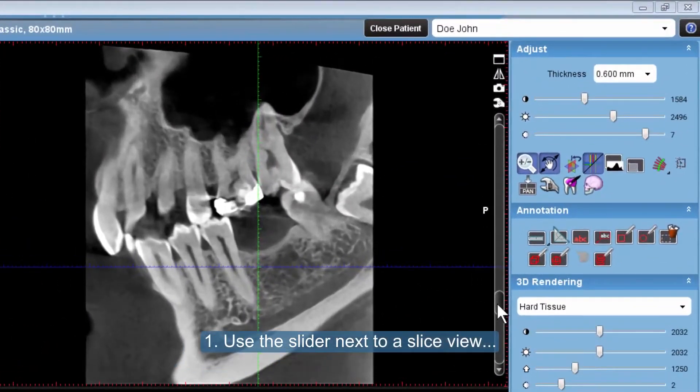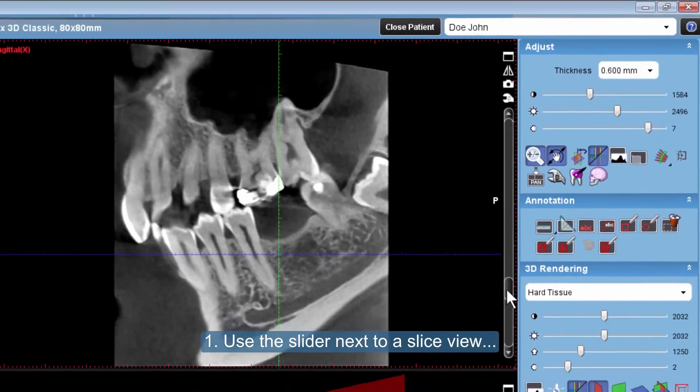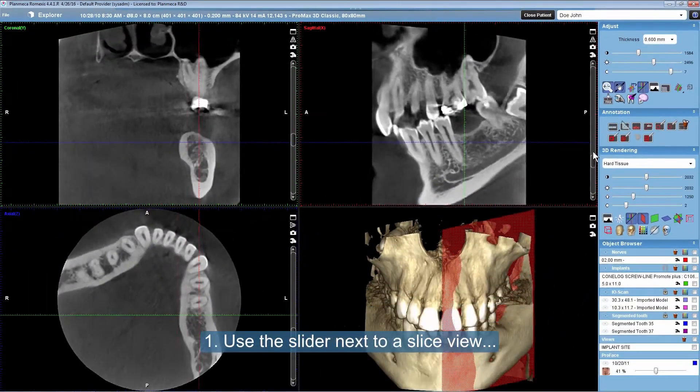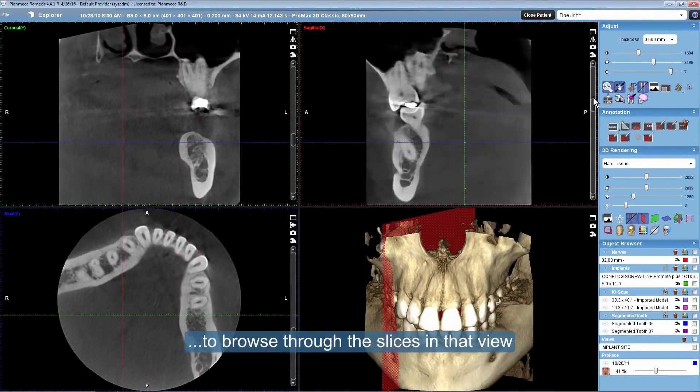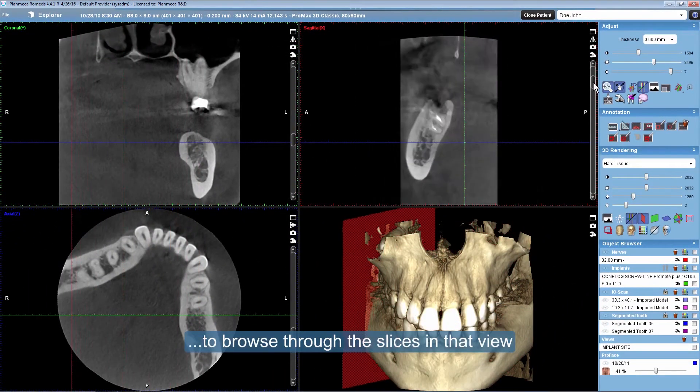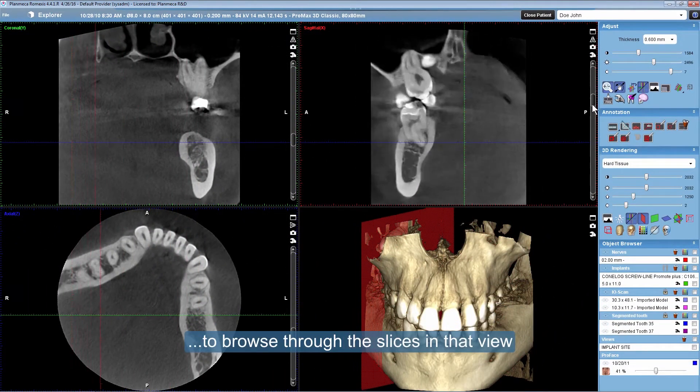Use the slider next to a slice view to browse through the slices in that view.